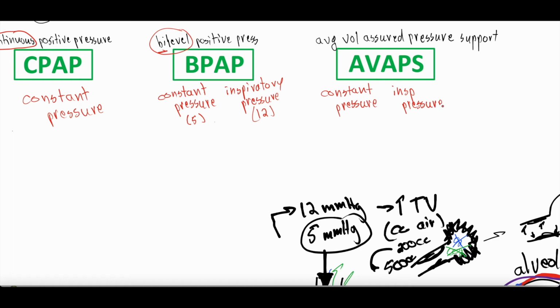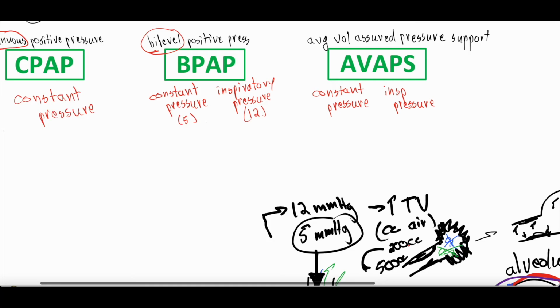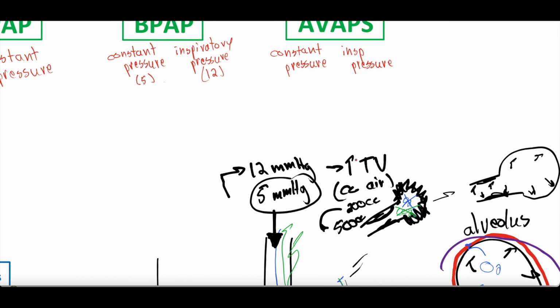And it says, all right, listen, instead of you just setting the inspiratory pressure, the amount of pressure you want me to give that patient when they take a breath, how about you tell me how many cc's of air you want them to breathe? Because we said we are setting the BiPAP inspiratory pressure to increase the amount of tidal volume, the cc's of air they're breathing with each breath. That's our goal. But we do it in an indirect way with BiPAP, right?